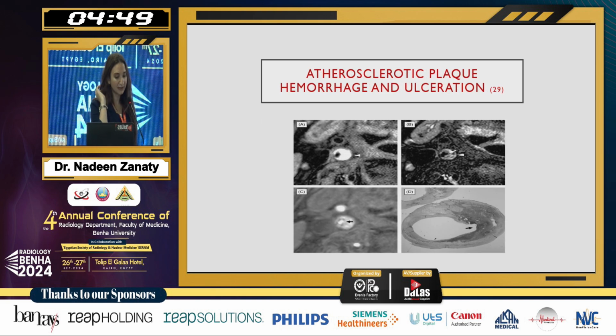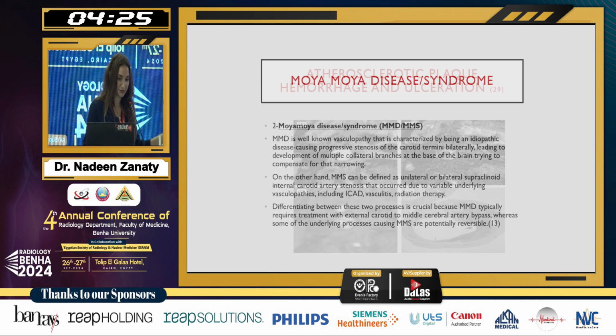Here is another plaque. The first one is the pre-contrast T1. As you can see, there is a high intensity signal inside the plaque, which means there is hemorrhage inside this plaque. On the second one, B, you can see there is luminal irregularity and an interrupted fibrous cap. That means that it has an ulcer. It's also noted in slide C, which is the MRA, and the histology shows the ulcer as well.